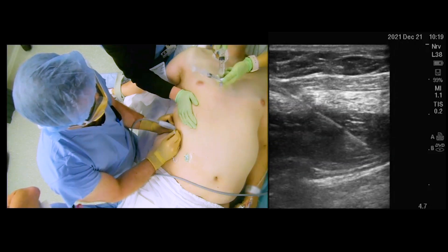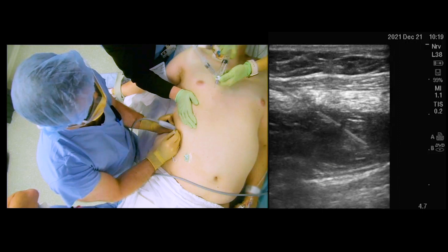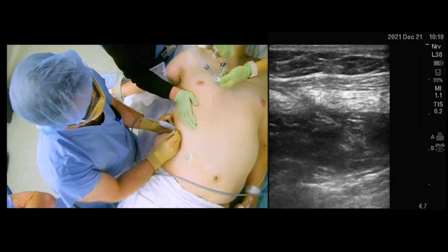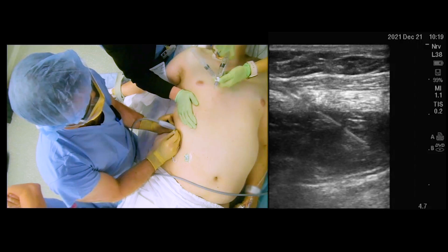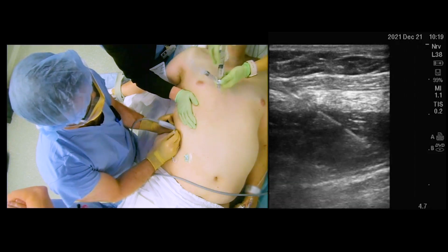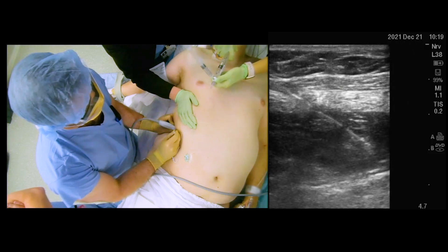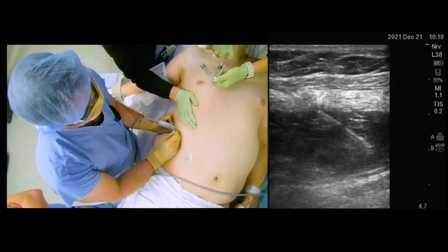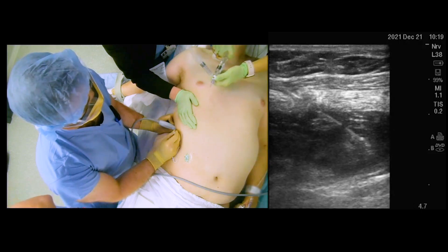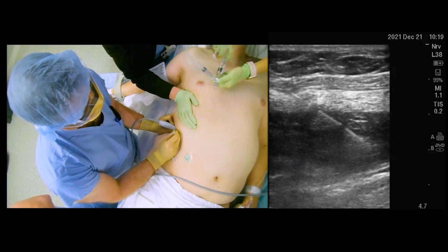The patient's total body weight was considered when deciding on the appropriate dose of local anesthetic for these blocks. 20 milliliters of 0.25% bupivacaine with 2 milligrams of preservative-free decadron was administered in 5 milliliter aliquots, with negative aspiration performed between each 5 milliliters to ensure no inadvertent intravenous injection.